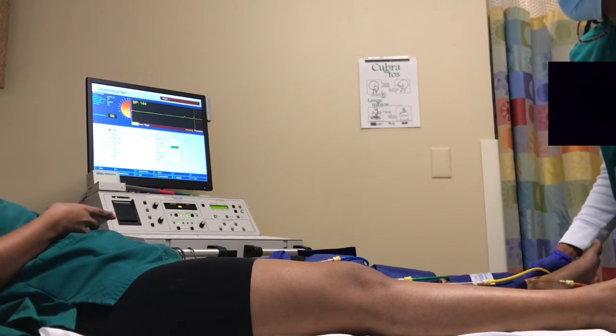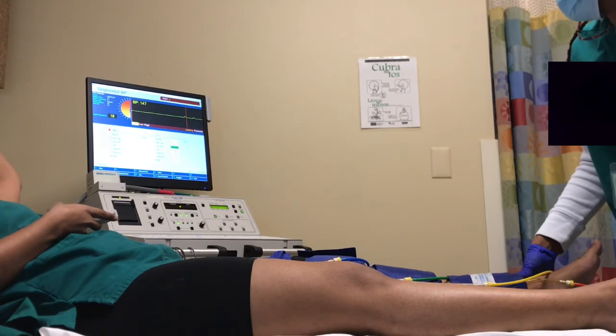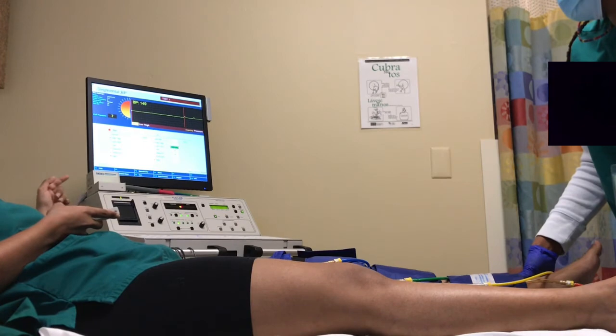So when you find the pulse, you take it from the first line you saw? Mm-hmm. Okay. So you listen for it first, and then you ask where it is. Because sometimes it's like here, or sometimes it's more than that. After that, they'll be here.